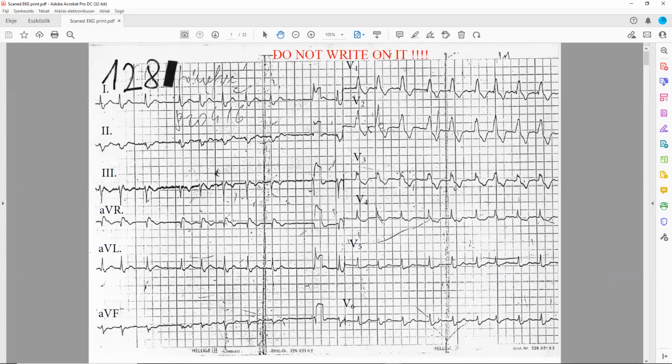What does it mean when we do have a supraventricular rhythm, such as an atrial fibrillation, plus a wide QRS complex? There is a ventricular fibrillation. No. We do have an intraventricular block. So we do have a problem with the activation of the ventricle.